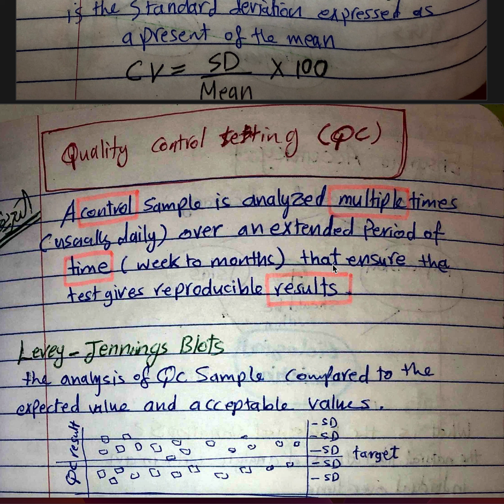Quality control testing is to analyze a control sample multiple times, I mean daily, over extended periods of time, weeks to months, to ensure that it gives reproducible results.